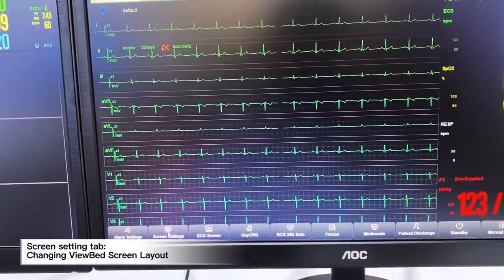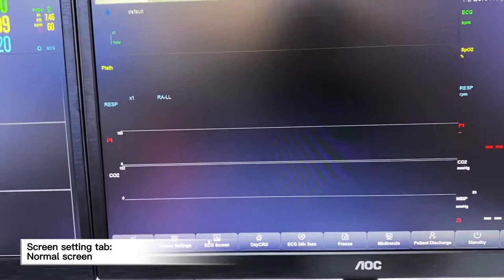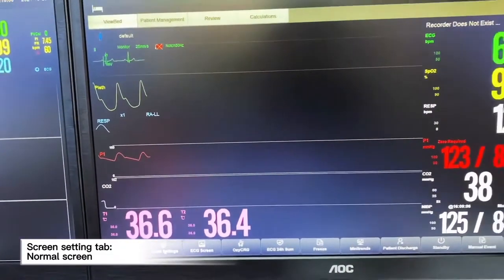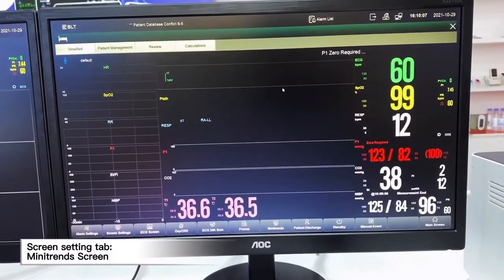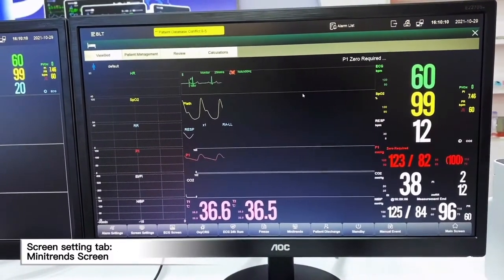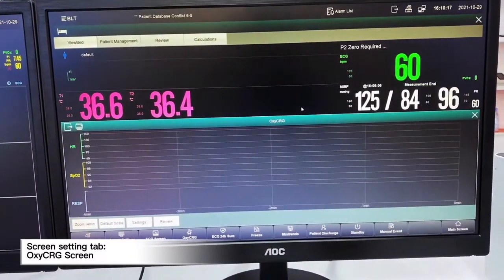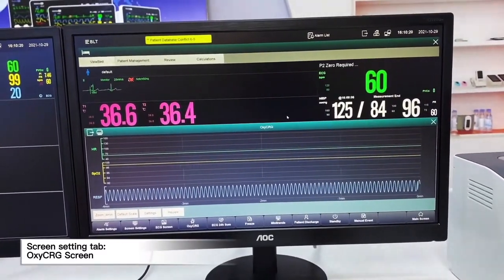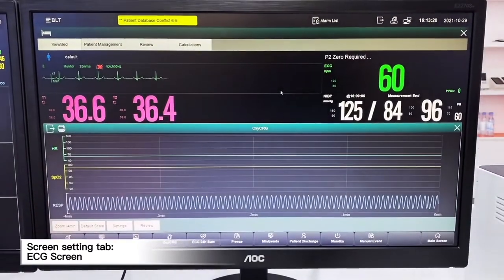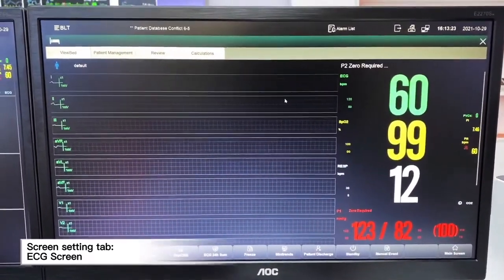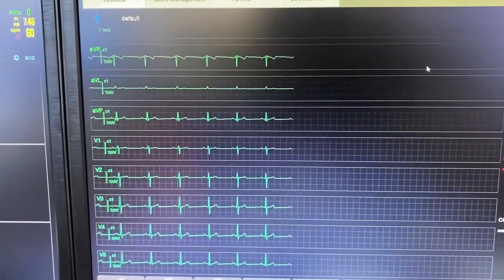We can also choose different screen displays — we can choose from normal screen, mini trend, Oxy CRG. When we choose the ECG screen, we will be able to see all top leads on the screen: leads 1, 2, 3, AVL, AVR, AVF, and V1 to V6.